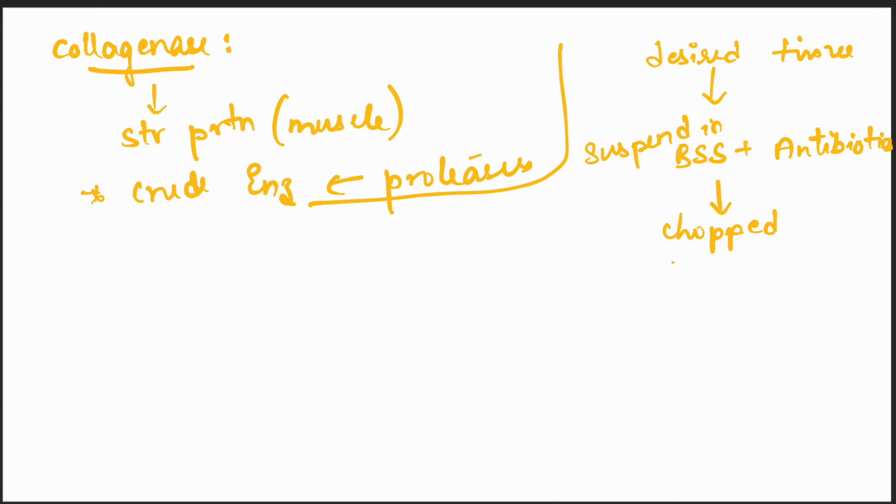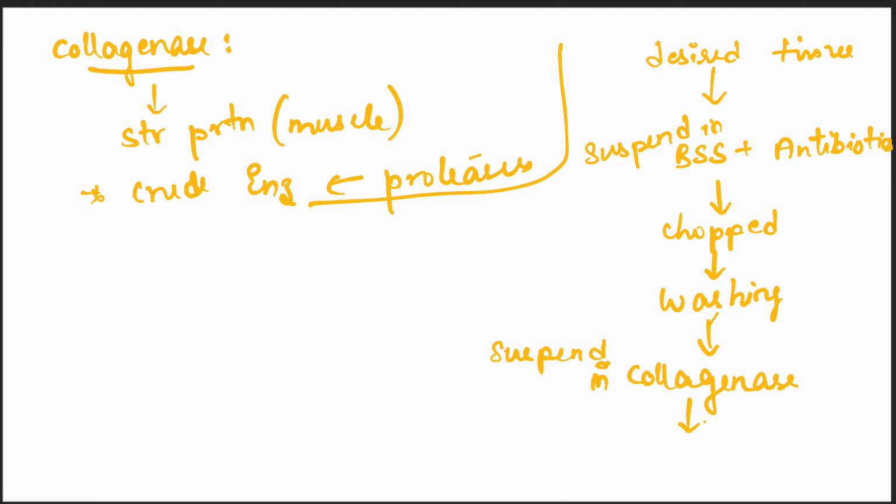After the chopping process we see the washing step. After washing, the tissue pieces are suspended in a medium containing the enzyme collagenase. After suspending in collagenase, this is incubated for 1 to 5 days.